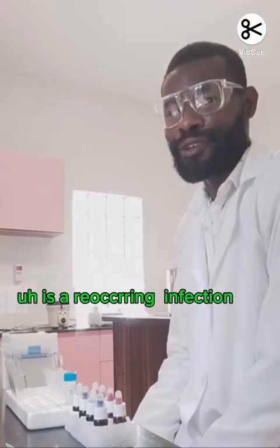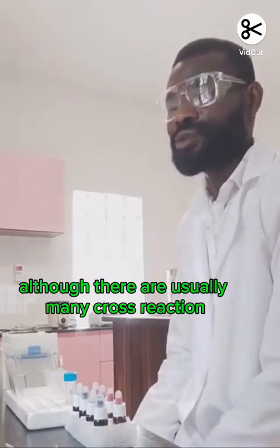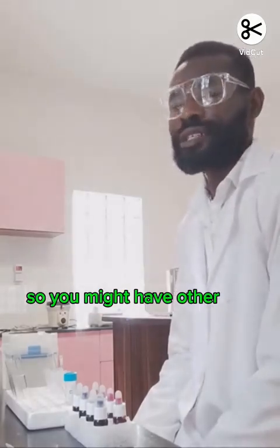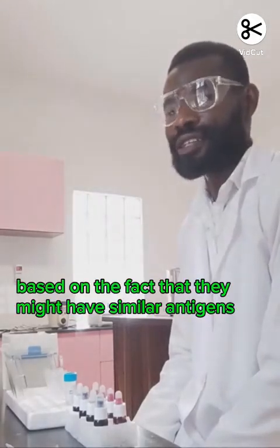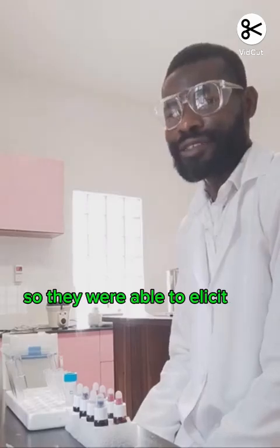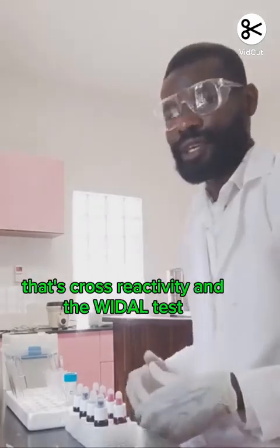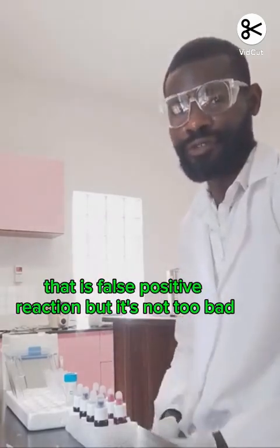a recurring infection, maybe a not well treated typhoid infection, although there are usually many cross reactions since it's a bacterial infection. You might have other bacteria that cause cross reactivities because they might have similar antigens, so they were able to elicit an antibody that is similar. Once you carry out this test, you have that cross reactivity, and the Widal test becomes positive. That is a false positive reaction.